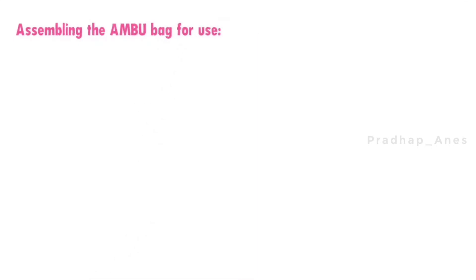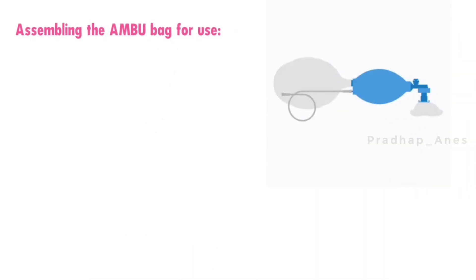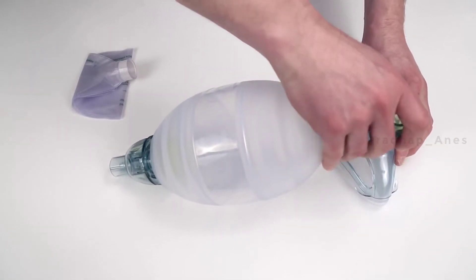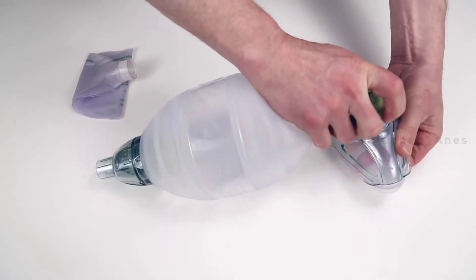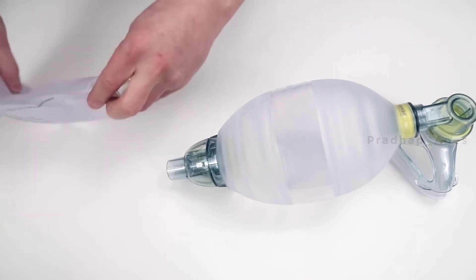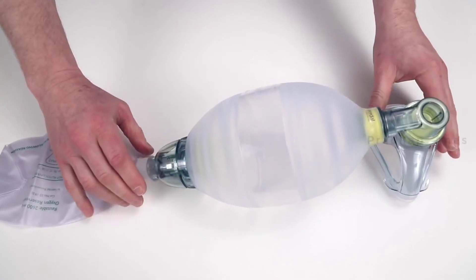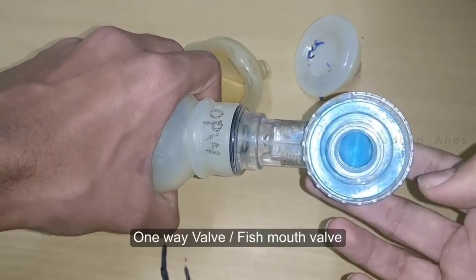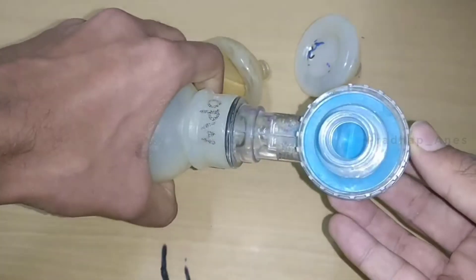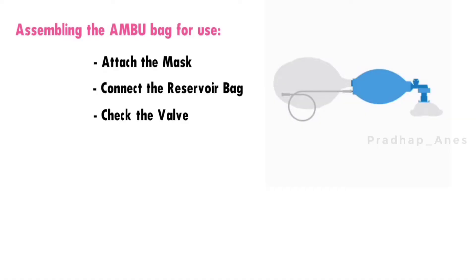Assemble. Now that we understand the main components, let's see how to assemble the ambu bag for use. First, securely attach the appropriate mask size to the valve of the ambu bag, and ensure it fits snugly to avoid any leaks. Next, connect the reservoir bag to the valve and make sure it is fully inflated before use. Before use, check the valve to ensure it is functioning correctly. Squeeze the bag and verify that air flows only in one direction, towards the patient.